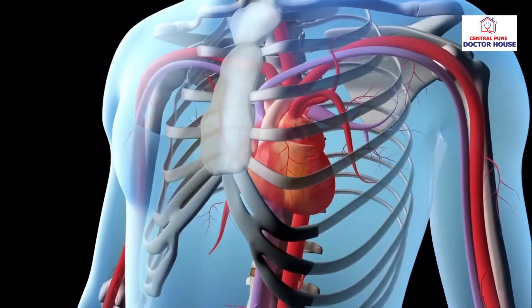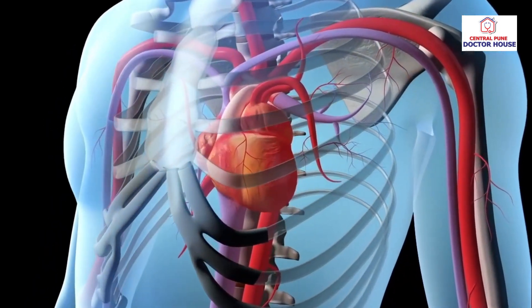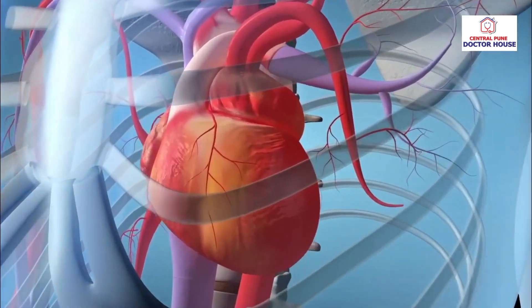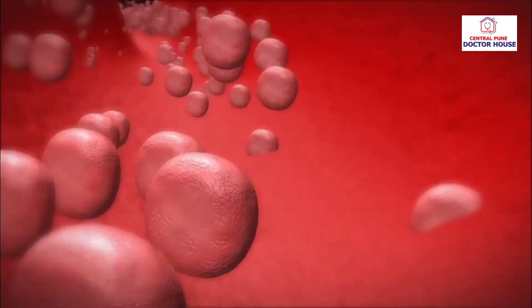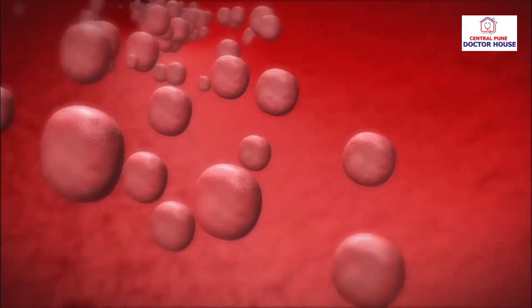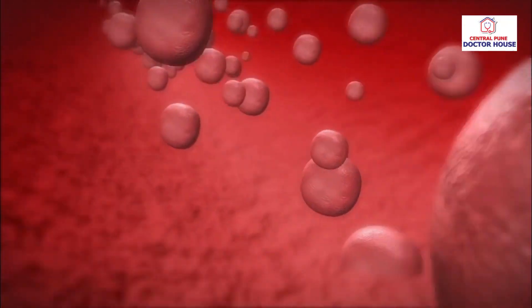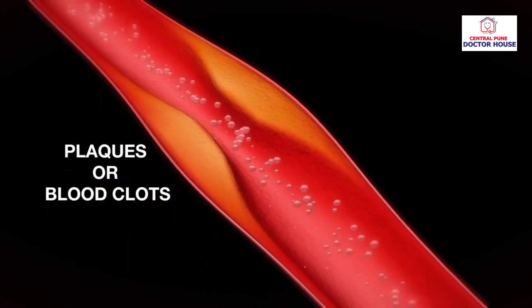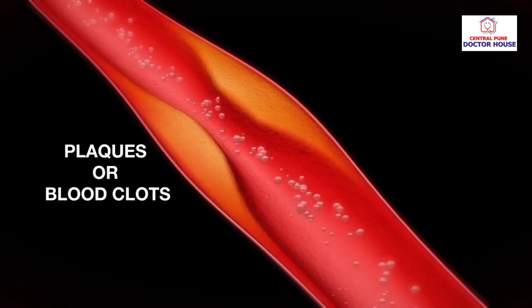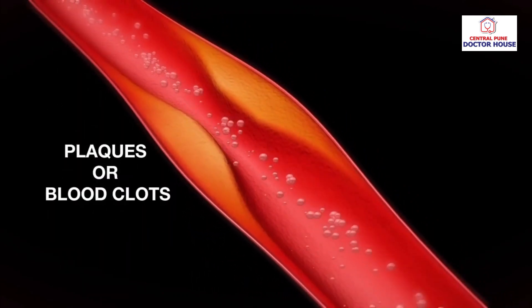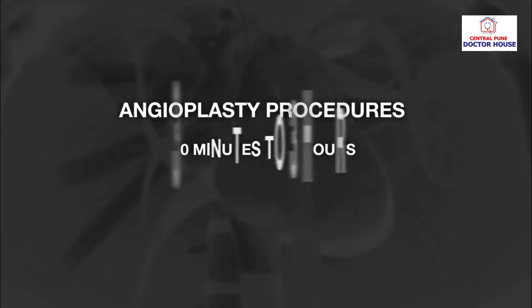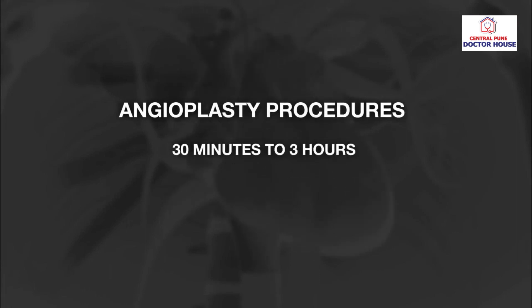Percutaneous transluminal or balloon angioplasty is a treatment procedure to restore blood flow in narrowed or blocked coronary arteries caused by plaques or blood clots. Most coronary angioplasty procedures last between 30 minutes to three hours.